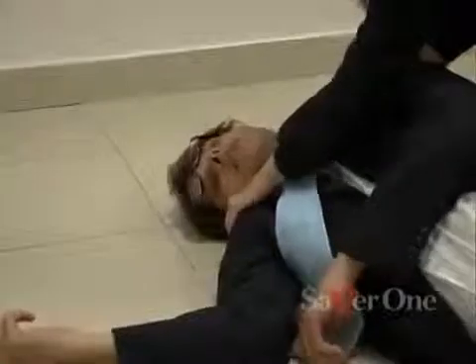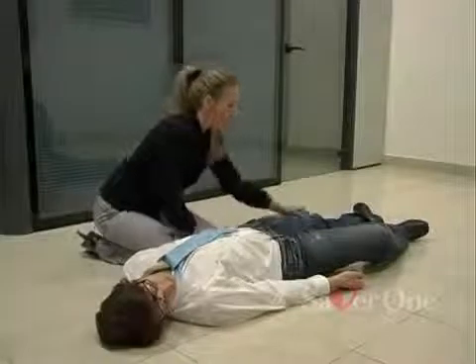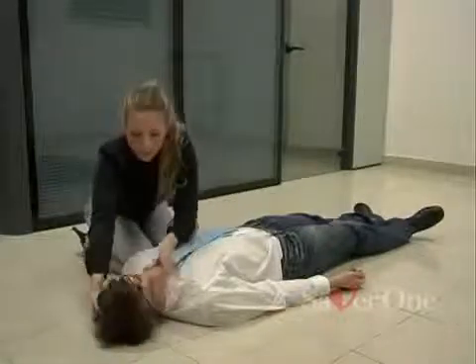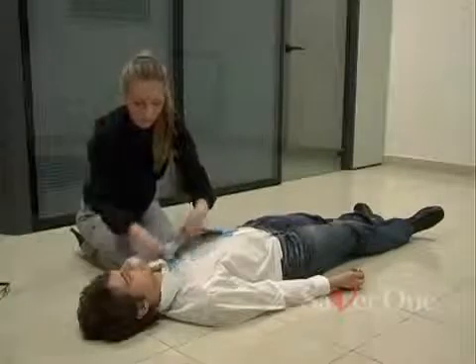Assess the patient's consciousness by calling him loudly and giving him a shrug. If he is unconscious, call for help if possible. Then lay him down on his back on a hard flat surface, arms parallel to the body. Then uncover the thorax.